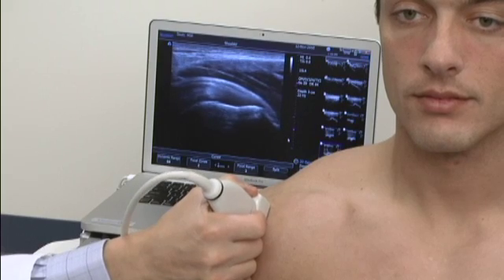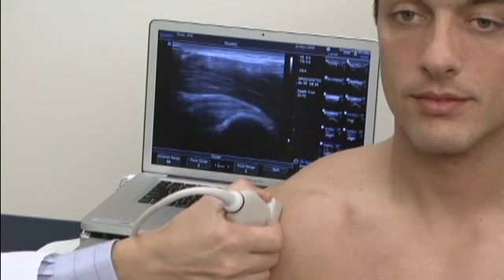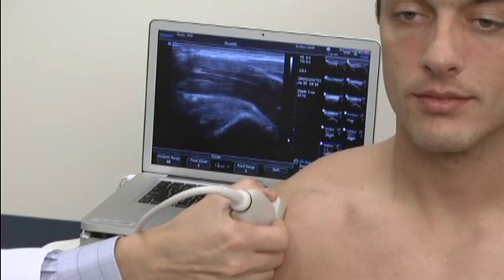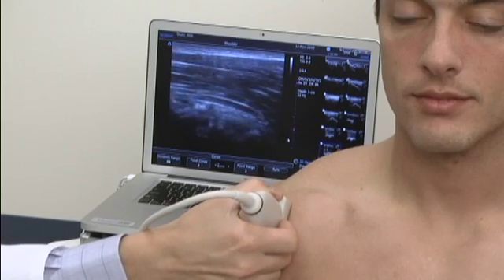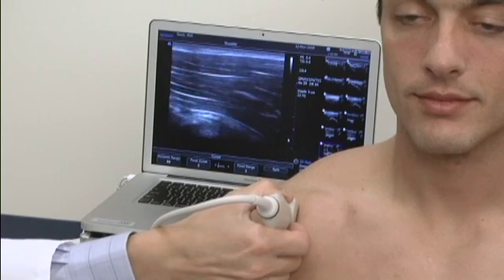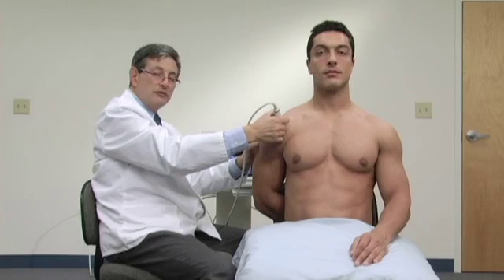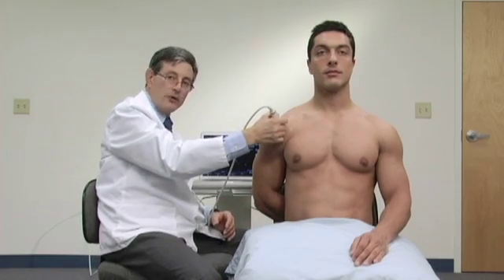As we go anterior — which will be medial in this case — we'll come to the point where we'll see the biceps tendon. So we want to go as far as we can to try to find the biceps tendon. Now it may be difficult in the CRASS position, so to make this a little easier, we're going to go to what we call a modified CRASS position.